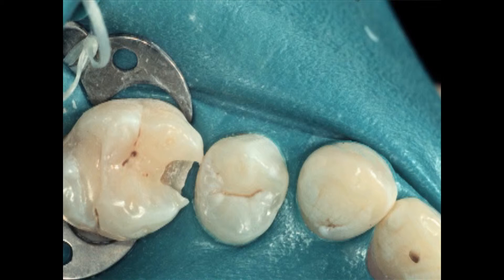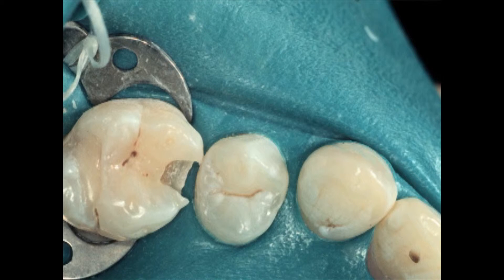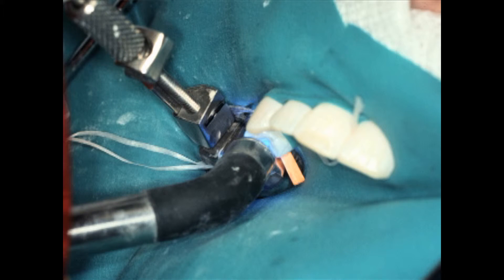The first time you do this, you're likely going to put in a lot of composite and end up with some flash. There are training-wheels approaches that can help. It's still a difficult problem — I'm still putting in more composite than I need about 60% of the time. But about 40% of the time I get it right, and when I do, the patient gets up and walks out after curing. When was the last time you did a class 2 composite and the occlusion was perfect and the patient just walked out?